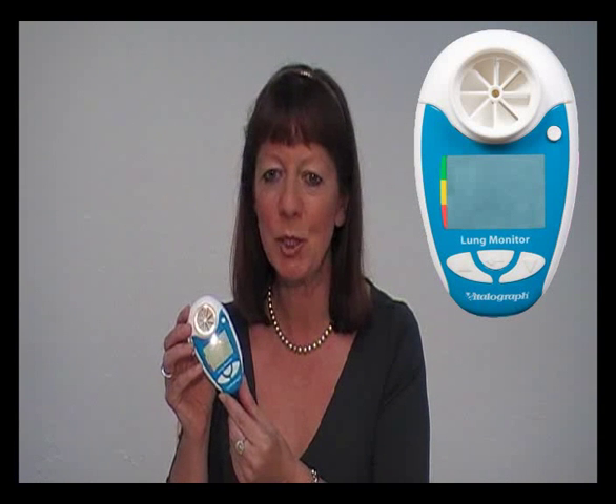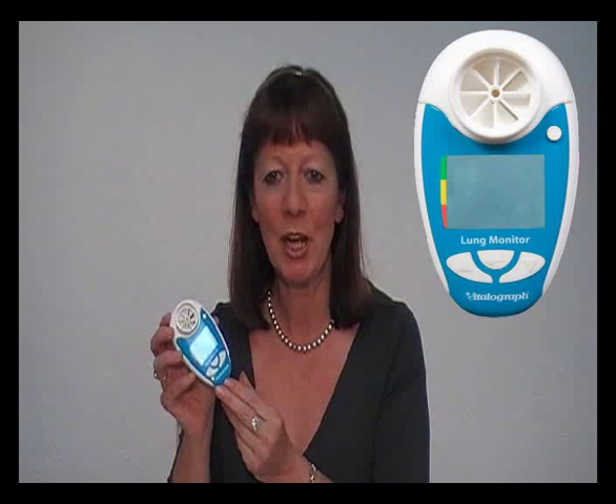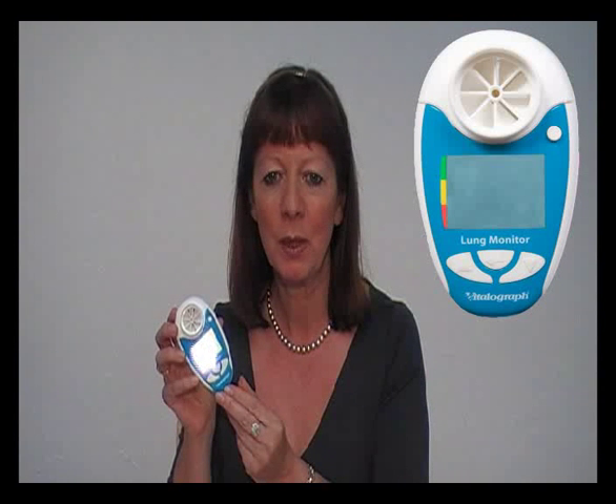A personal best can be entered and it will store up to 200 test sessions. If you have the USB version of the device, you will also be able to measure forced expiratory flow and generate a PDF report which can be archived or printed.